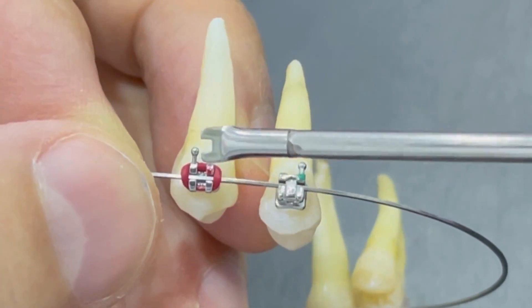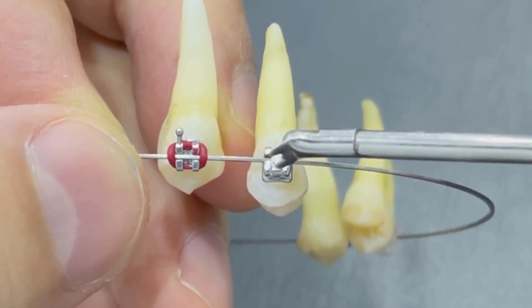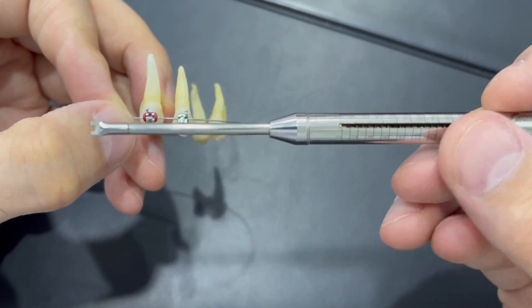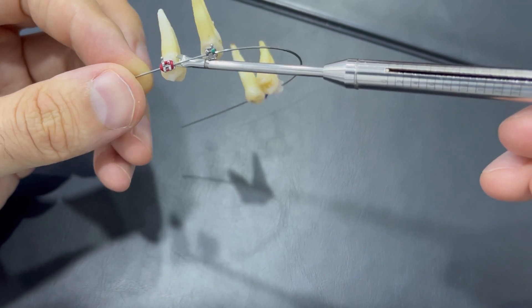The difference between normal traditional ligating braces and self-ligating braces. This is a 1725 steel wire and this is the force gauge. We are going to measure the force needed to move each type of braces.